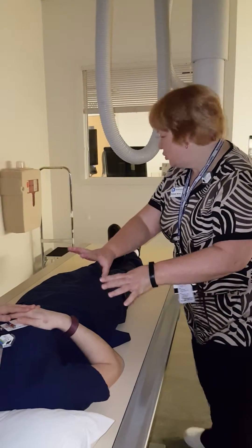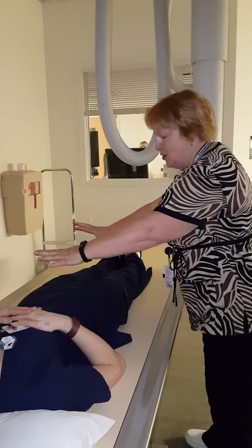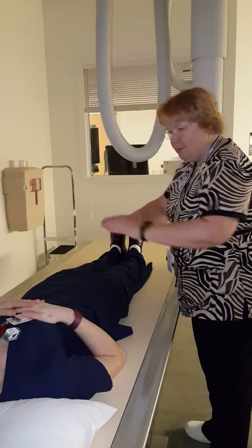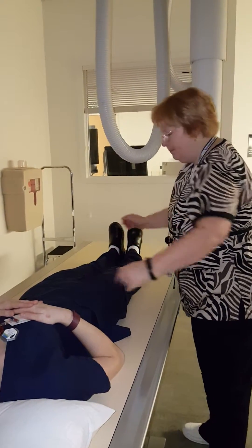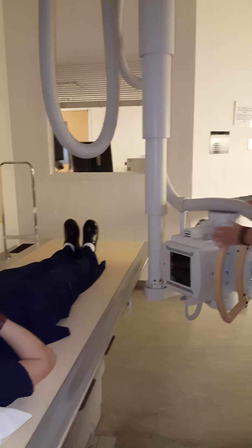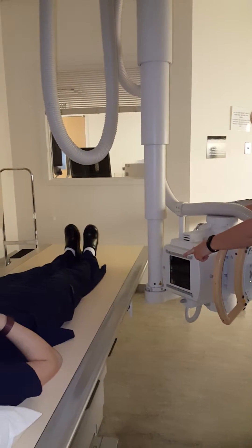Make sure that your patient is lying straight on the table. We will be moving her over to the edge of the table in a bit, but the most important thing is making sure she's completely straight on the table. From there, you need to make sure that the tube is angled at a 45 degree angle to the long axis of the table.